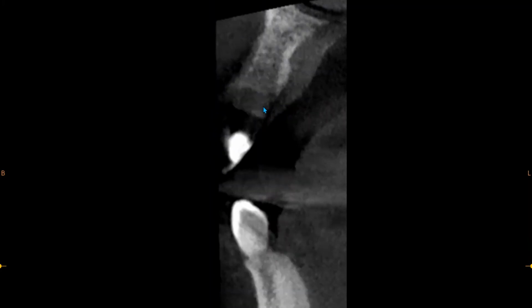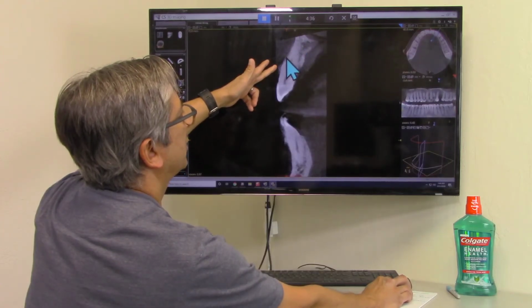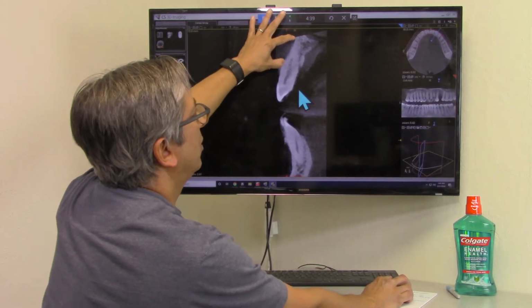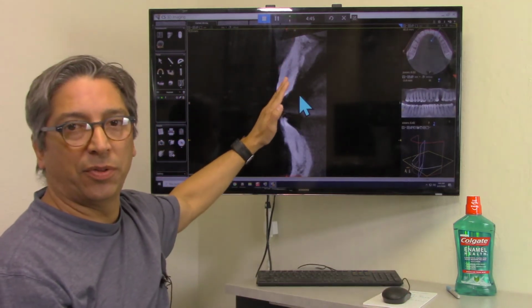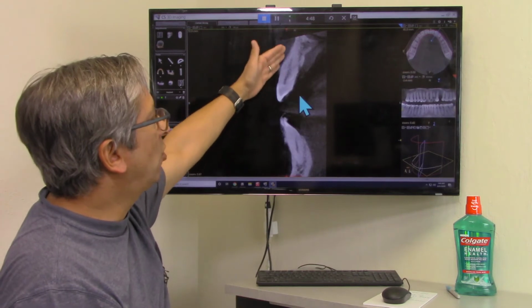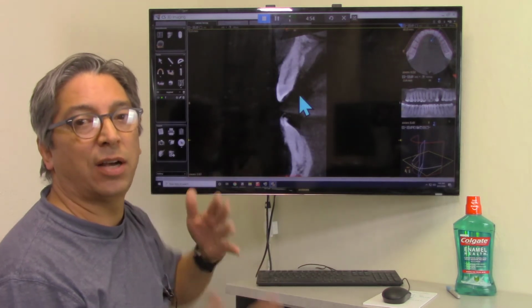Let me go a little bit more in this direction, and you'll see the quality of bone's not bad, but here's the tooth next door, and if we go right down the middle, here's the nerve. You can see on the tooth next door, we really don't have what we would call the facial plate here. So when this tooth gets extracted, you're going to have a void all the way around like this, and you're going to have to help hold the space out here that was once held by the actual tooth. The actual tooth was holding that tissue back, and when it's taken away, everything collapses in, causing a defect.